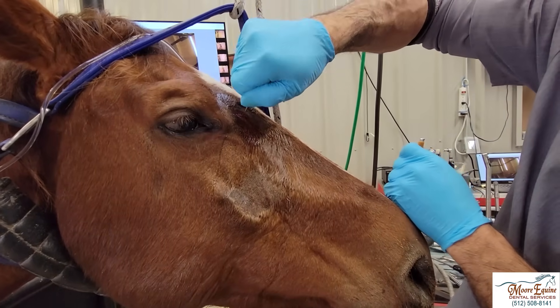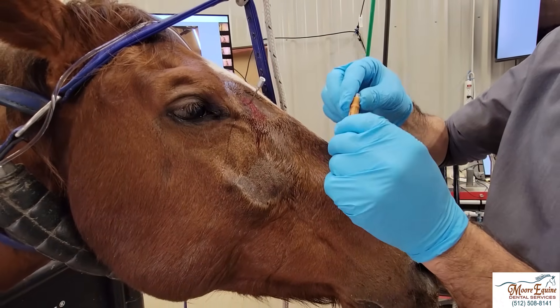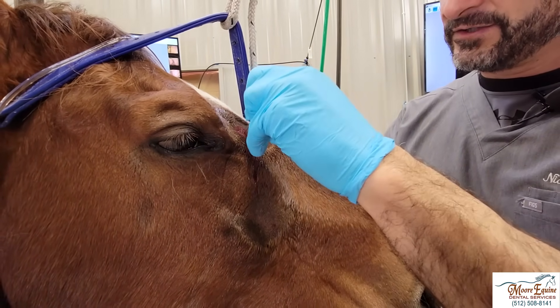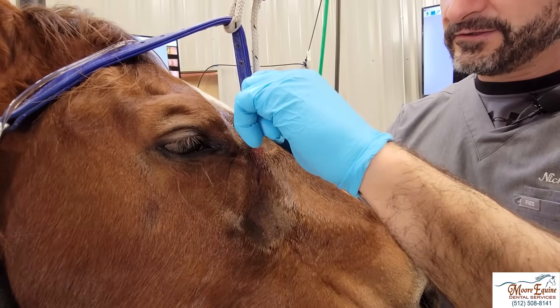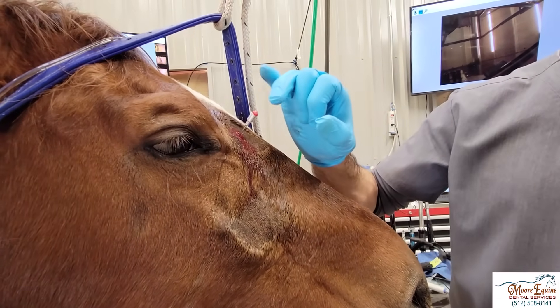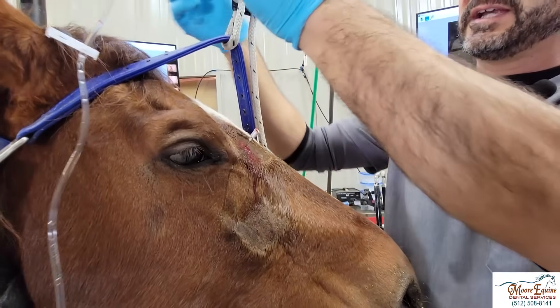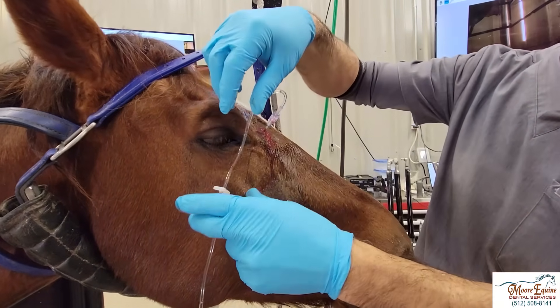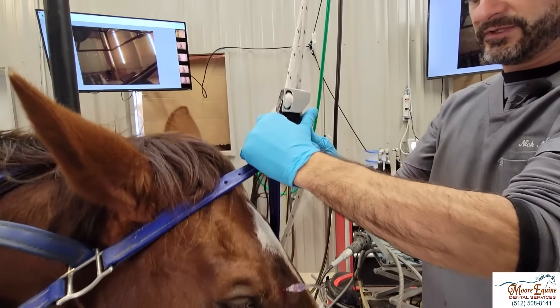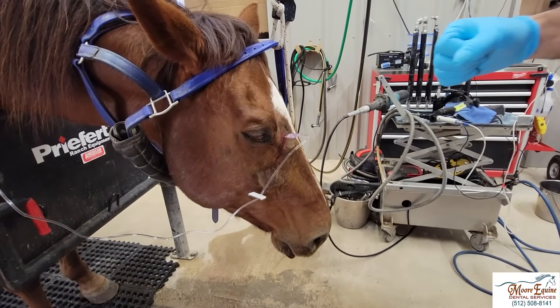What happens is my needle has filled with a little piece of bone, so I'm going to take this needle out. You want to note the angle your needle is at, because the hardest part of this job is putting your new needle in the exact same angle and place as the old one — you have to find that little hole. You can see the air bubbles from the breathing. Now I'm putting in the other needle. I'm going to hook up my saline bag and lower her head down so that it flushes out the nostrils. You'll see the fluid running out her nostril.